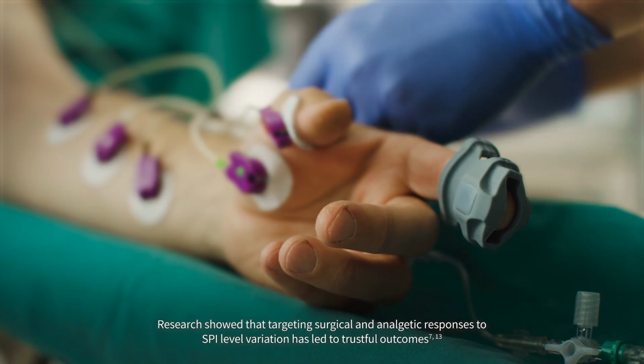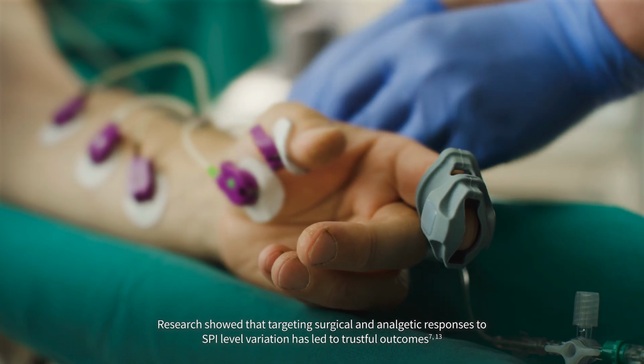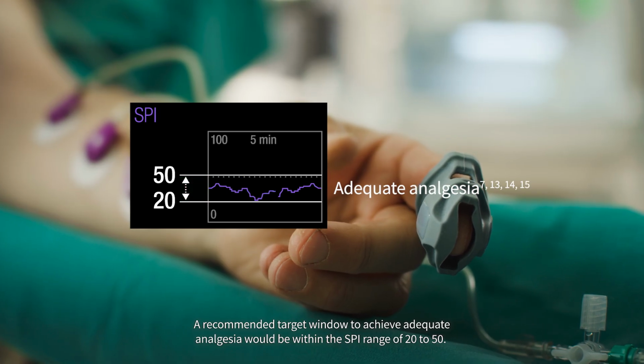Research showed that targeting surgical and analgetic responses to SPI level variation has led to trustful outcomes. A recommended target window to achieve adequate analgesia would be within the SPI range of 20 to 50.